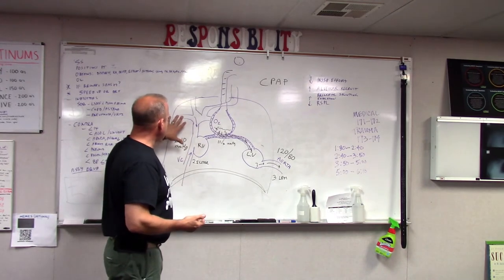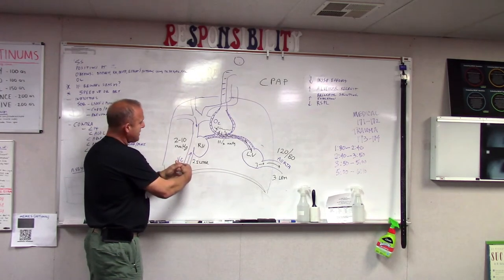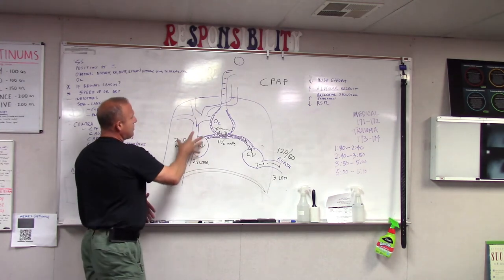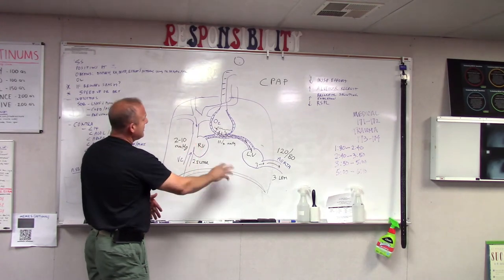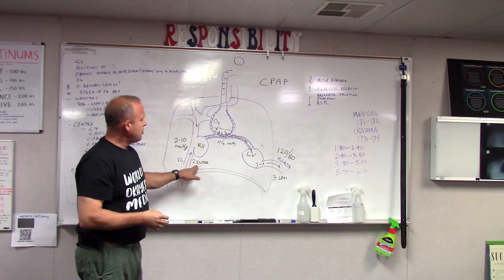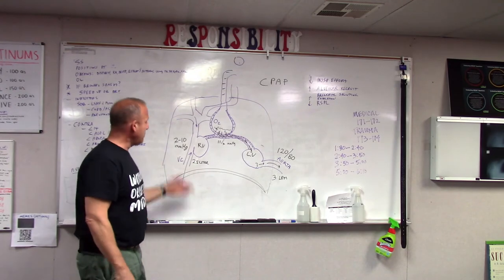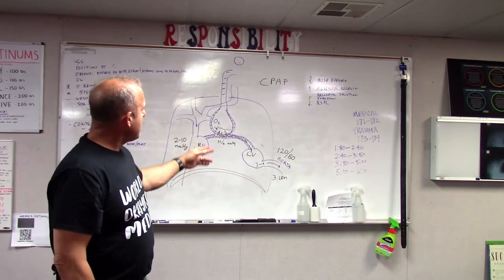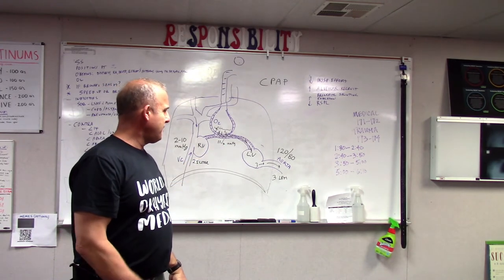As it increases its pressure, guess what it does to the vena cava? It basically, as it passes through the diaphragm, from an area of lower pressure in your gut to now an area of higher pressure in your thoracic cavity, the diaphragm's the wall, sort of like an IUD diaphragm, right? This reduces flow also. So CPAP has the effect, just like transmucosal or transdermal nitroglycerin, of reducing preload. By reducing preload, we again give the left side of the heart a break. Not fixing anything, but we're keeping the person from dying. We let the left heart pump as if it was in a boat with a leaking hole.